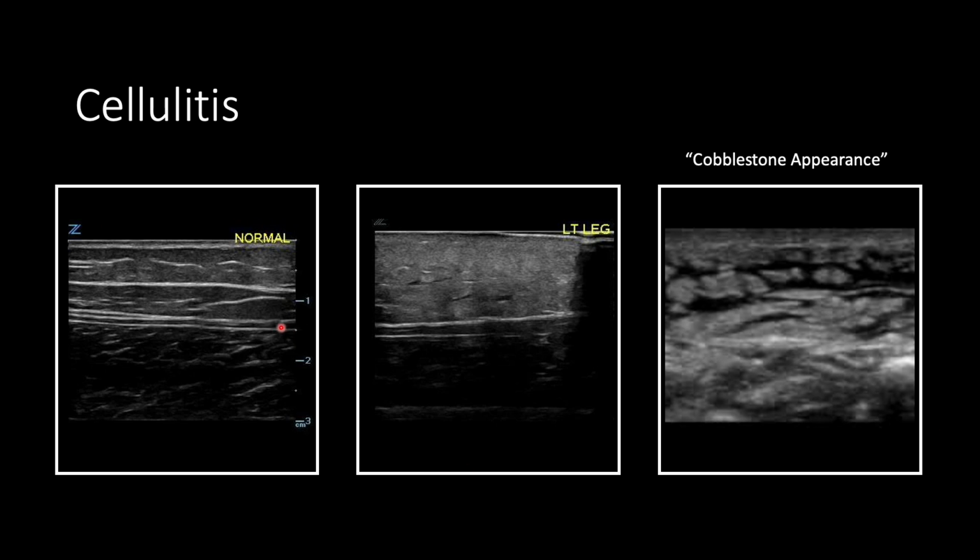So we go from essentially no little pools of echogenicity or anechoic, hypoechoic areas to this middle section where we're starting to get these little lacunae. We're starting to see more of a bundled approach. Everything appears a little bit brighter from that initial swelling and edema. And then finally, as that fluid coalesces around these different, more confluent structures inside the subcutaneous tissue, you get the classic cobblestone.